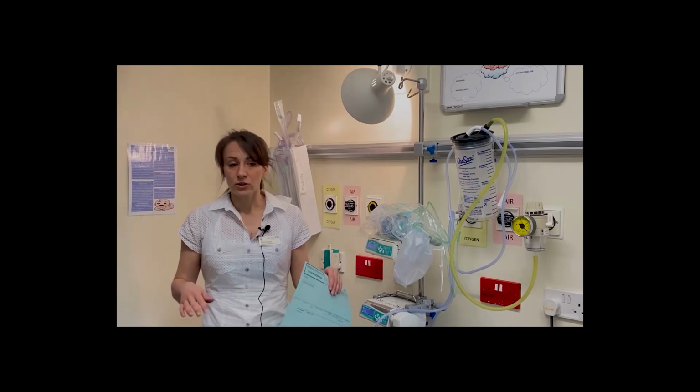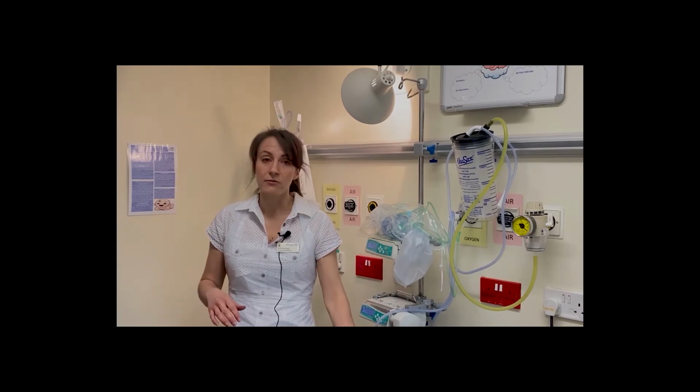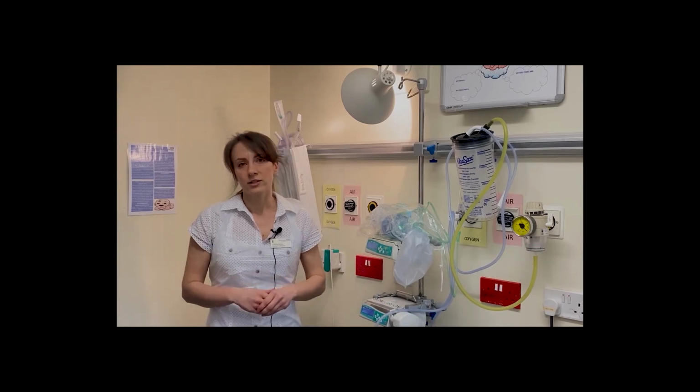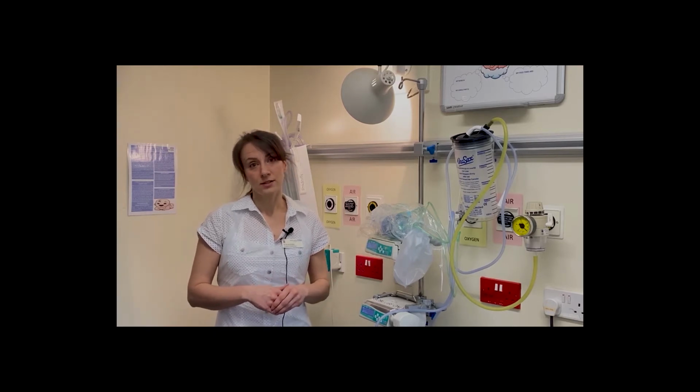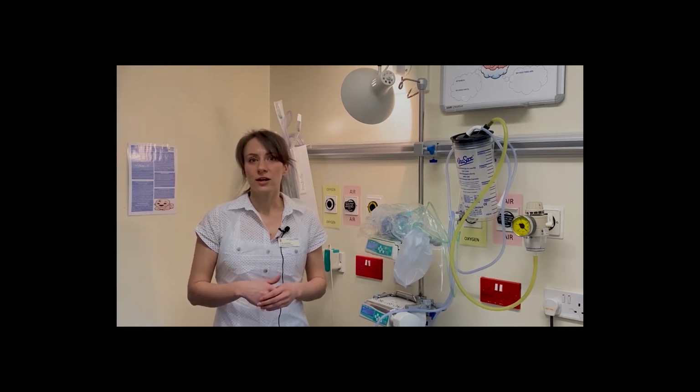Then you want to make sure that you've got enough space around the area, around the baby therm or the resuscitaire. The nurse looking after the baby can help assist with this, and it's important that they're aware the procedure is about to take place.